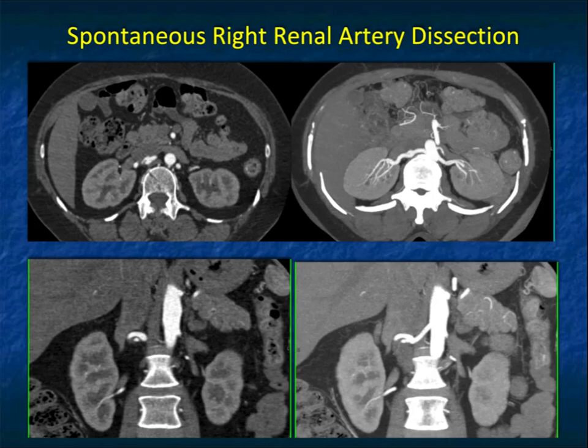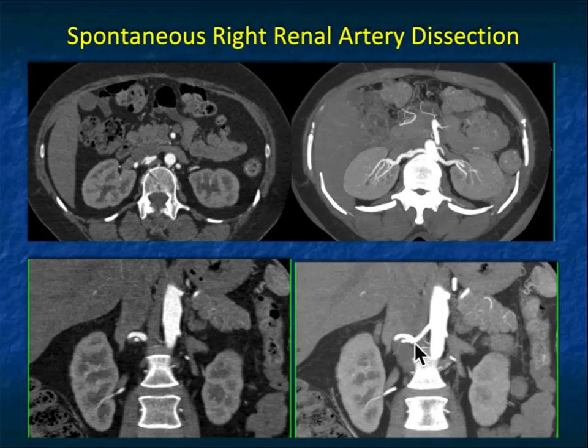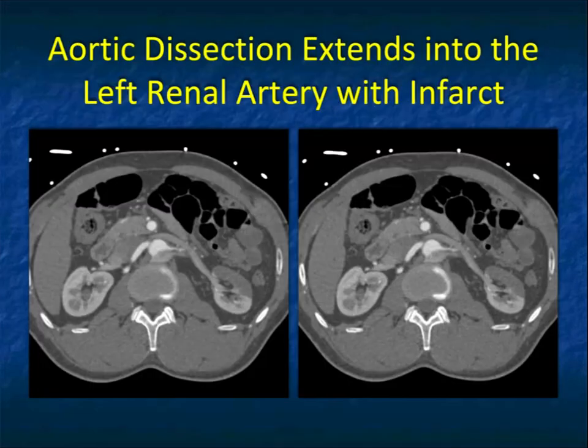Here's a nice example. Looking at the right renal artery, it's irregular — very nicely shown on the axial and the multiplanar. On the 3D imaging, you can see very nicely this focal dissection in the patient's renal artery. This was a spontaneous dissection; the patient had some flank pain.